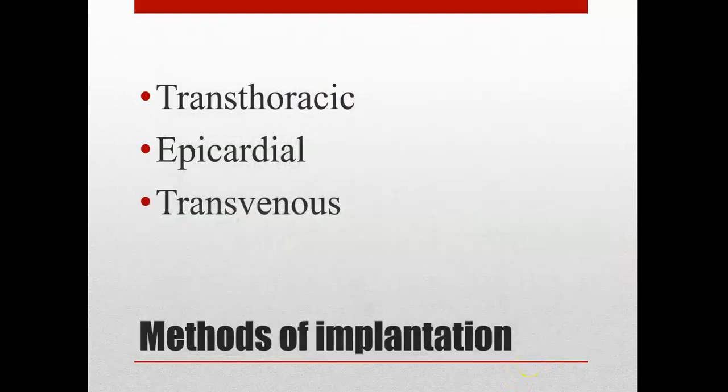All right, so modes of implantation. So how can we deliver? So obviously we've got an implantable one that sits in the patient's heart, and it sits in their myocardium, but we can also have some other types. So we've got transthoracic, epicardial, and then transvenous.